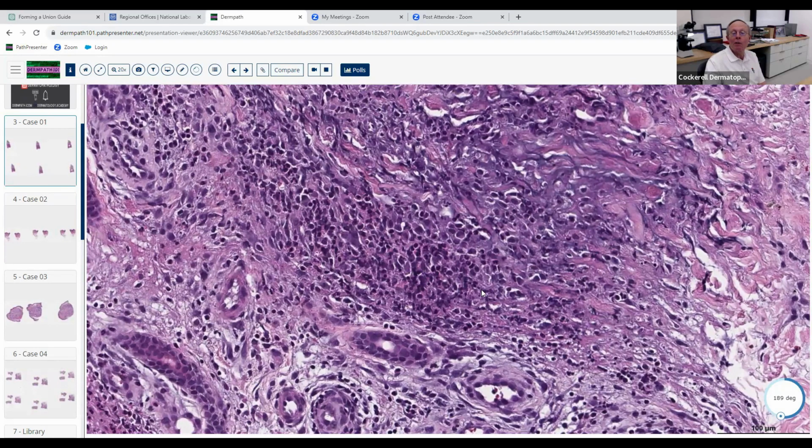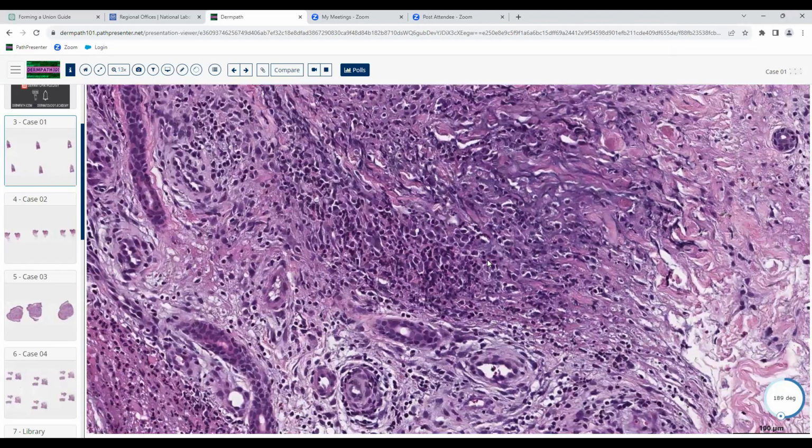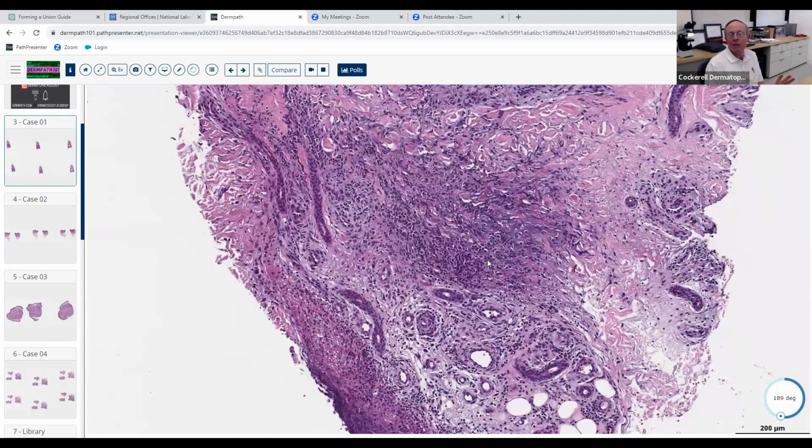So what kind of cells are we looking at right here? You said it a minute ago. Neutrophils? Yeah. So we got palisaded granulomatous dermatitis, but we've got neutrophils in there. So suddenly you say, well, wait, that doesn't fit with any of the three classic ones. GA usually has mucin, rheumatoid nodules have fibrin, NLD has degenerated collagen. Well, now we've got polys in here plus palisaded granulomatous dermatitis.